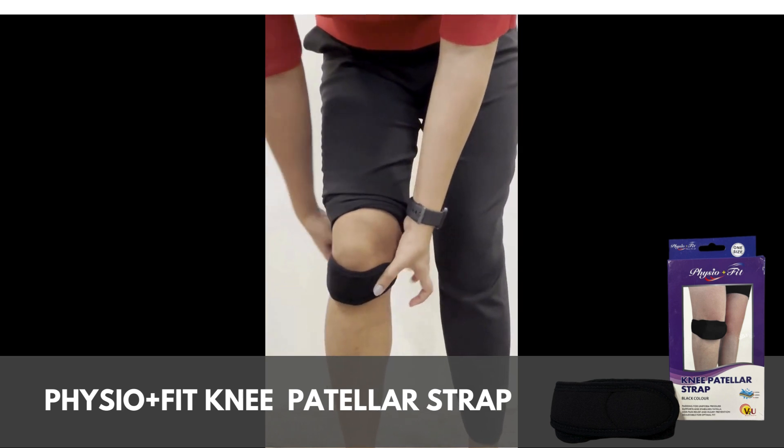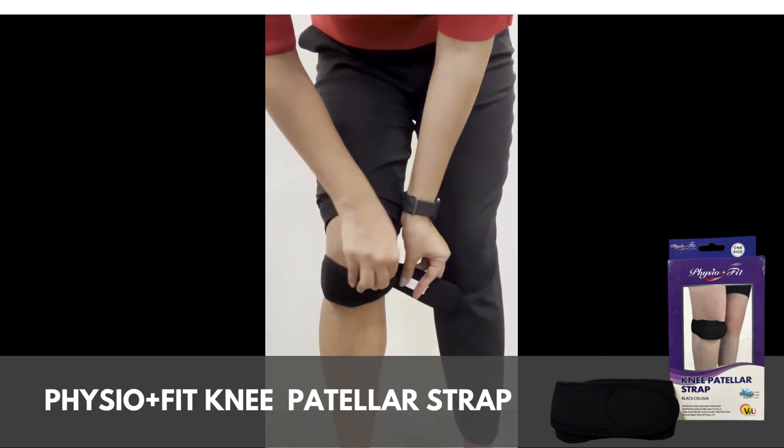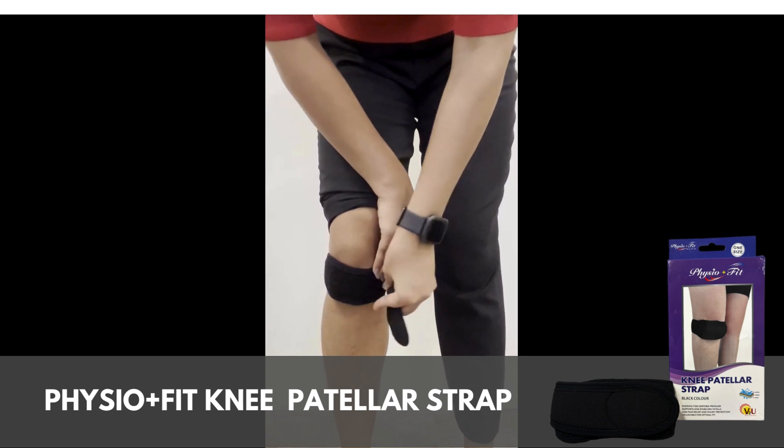Wrap the strap around and fasten the velcro. Make sure the support feels firm and comfortable.